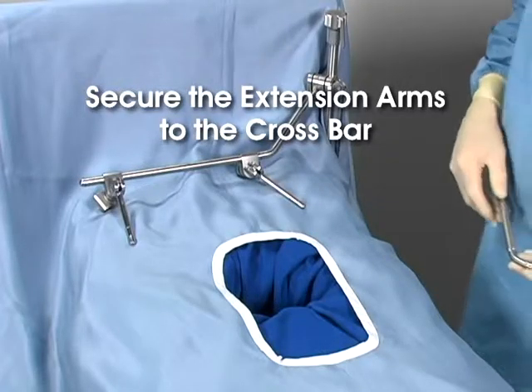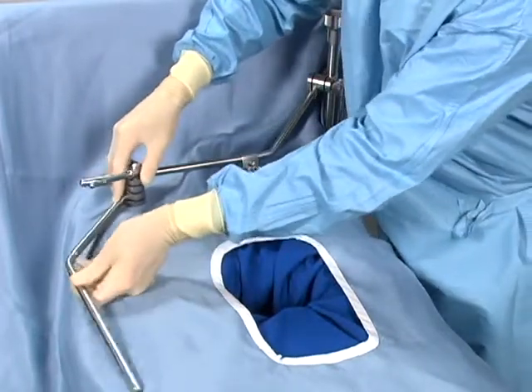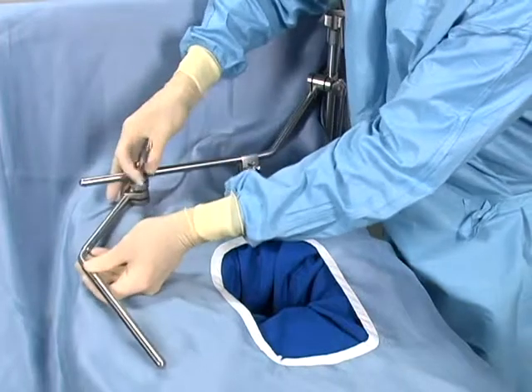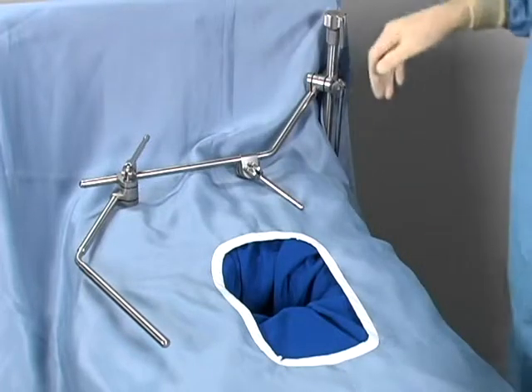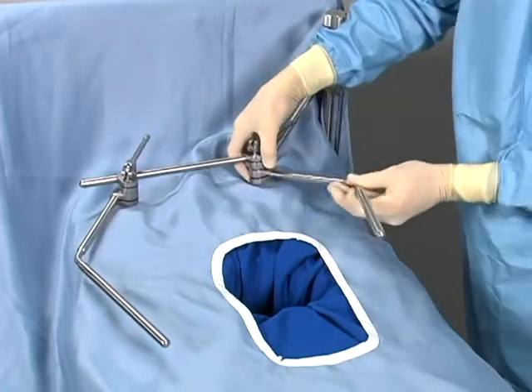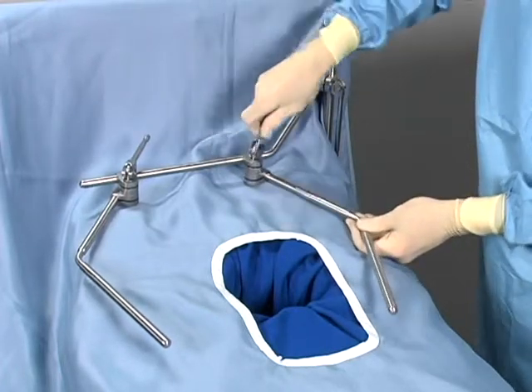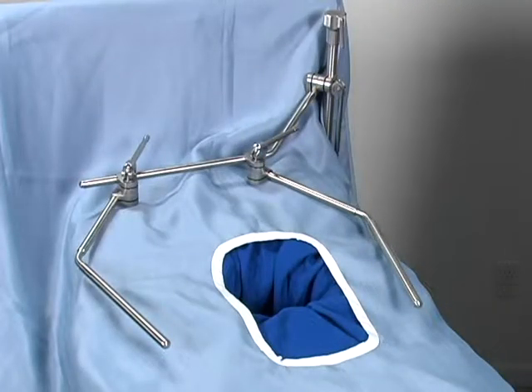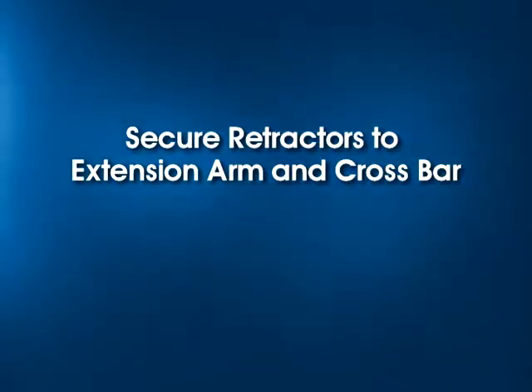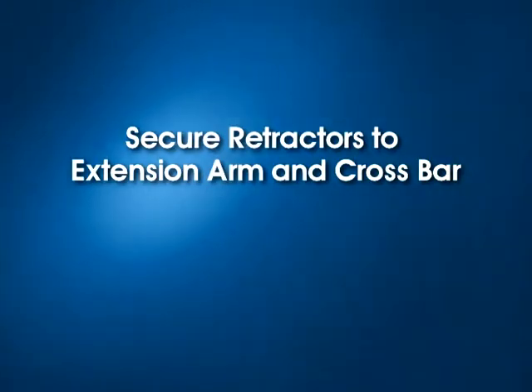Secure the extension arms to the crossbar. Position the arms just above the horizon of the patient. The height of the arms can be adjusted independently to facilitate retractor placement for towing under, elevating, or pulling down on the margins. Be sure to leave enough room between each arm and the incision for retraction. A quick flip of the handle instantly secures the cam joint, locking the arm in place. Now that the frame is in place, the retractor blades can be positioned. The design of the crossbar and extension arm allow retractors to be mounted directly to either bar.